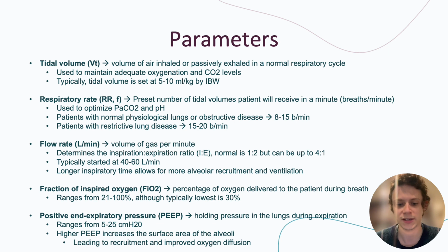So higher PEEPs increase the surface area of the alveoli. So think of the balloon. If you're not letting as much air out, the balloon is bigger. It has more surface area, and that leads to recruitment of alveoli and improved oxygen diffusion. The issue with higher PEEPs, though, is it can lead to increased cardiothoracic pressure, so there are downsides to high PEEP.